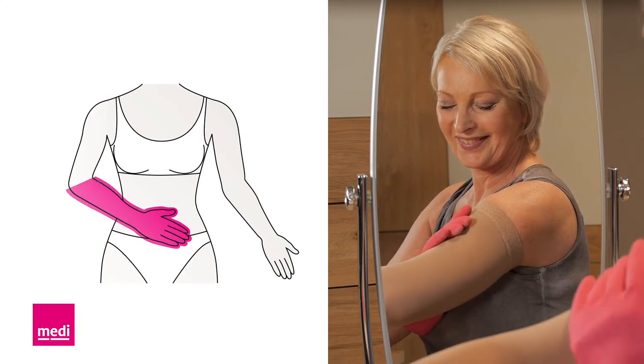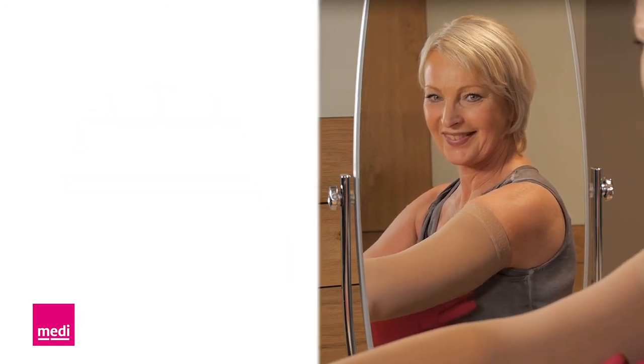An arm sleeve should reach as far as possible into the axilla, but without folding over or chafing. Make sure the ellipse fits properly over your elbow — the oval ellipse should lie over the bend in the elbow.